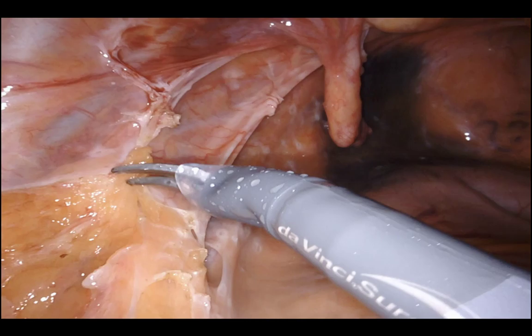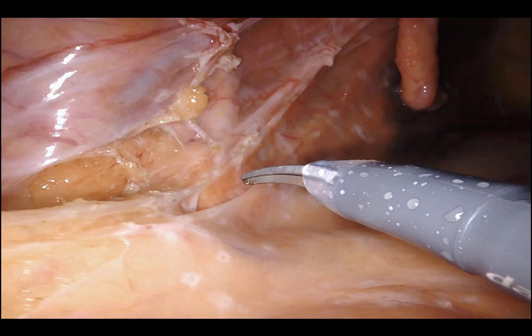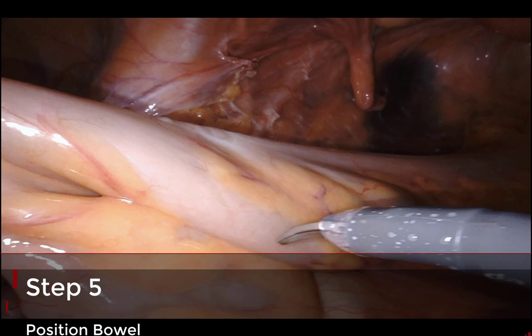Here we're doing lateral attachment dissection, looking for the intersigmoid fossa — immediately deep to that fossa is the left ureter. I'll continue this dissection, speed it up just a touch. These lateral attachments are coming along pretty well; at this point I could probably transition to a medial dissection. And just a second — there's the left ureter.